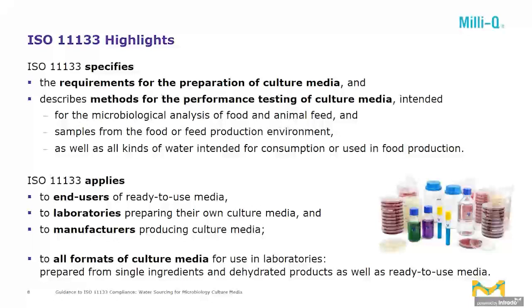For whom does ISO 11133 apply? It applies to end users in the lab of ready-to-use media, to laboratories preparing their own culture media, and to manufacturers producing culture media and selling these to the laboratories. It applies to all formats of culture media for use in laboratories for microbiology, of course, prepared from single ingredients, prepared from dehydrated products, as well as ready-to-use media.